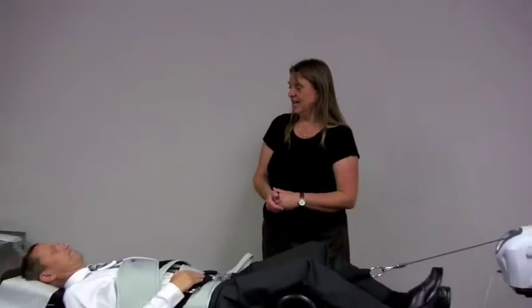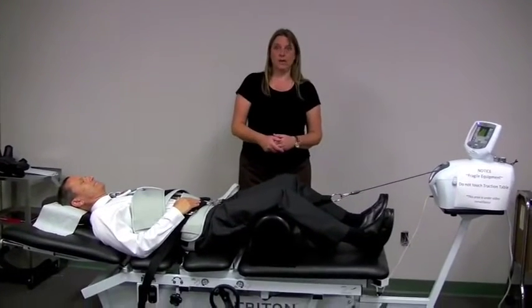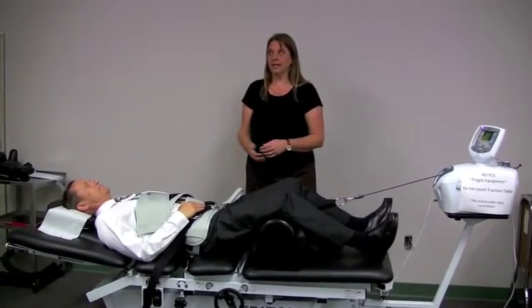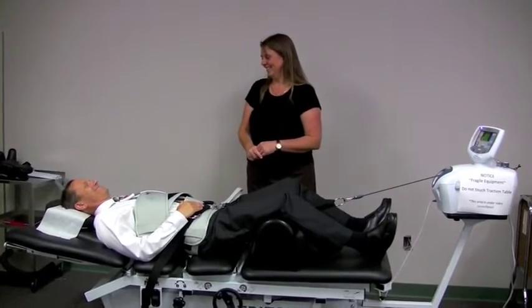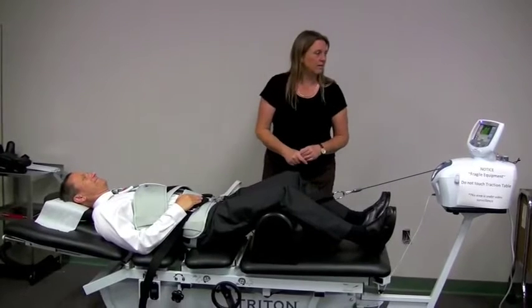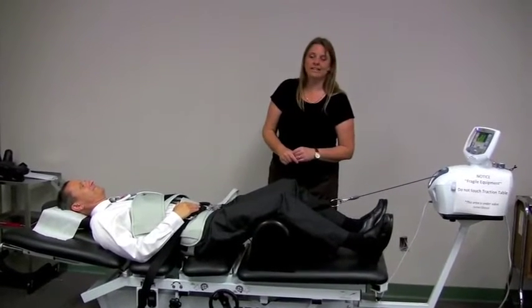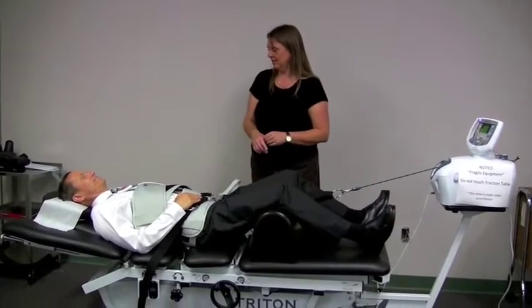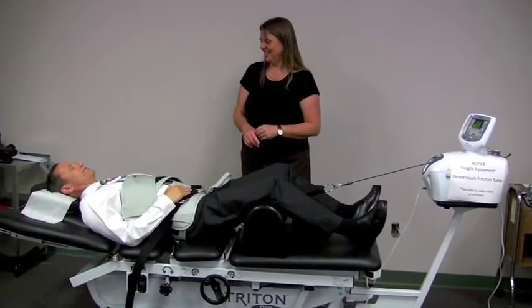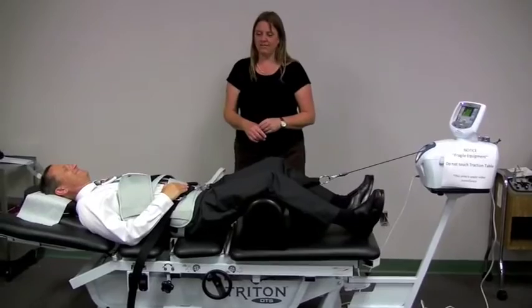You're at 44 pounds again. Okay. So I would suggest for your patients, get them a good magazine, let them install a pretty picture up on the ceiling, give them something to do. Apparently a lot of patients fall asleep during traction. So could you see falling asleep? Yeah, I think so. It's just sort of, you're all comfy cozy.